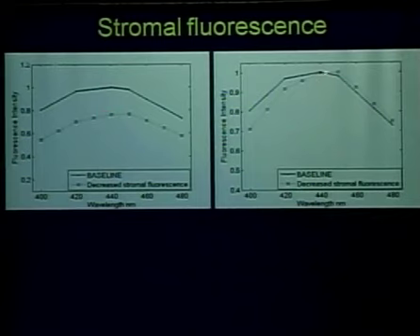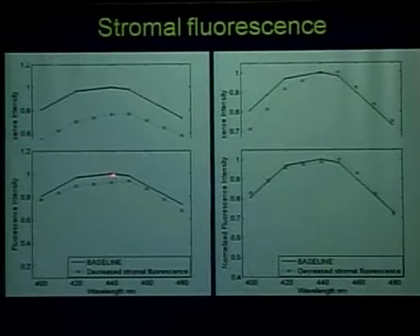And you also see now the shift over to longer emission wavelengths. If I leave alone that superficial stroma and I only change the optical properties of the deep stroma, you can see there's very little effect. Here's the baseline case. Here's changing the optical properties of the deeper stroma. So with this particular probe geometry, we're sampling the epithelium and about the top 125 microns of the stroma.